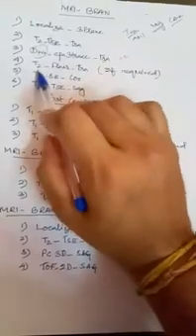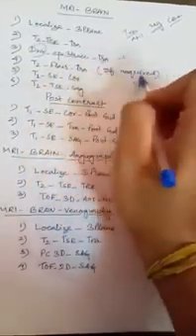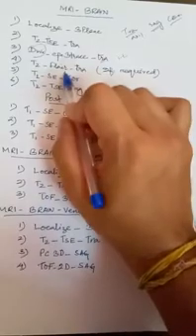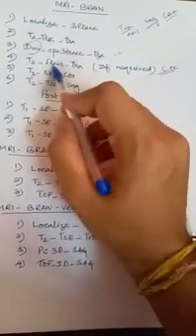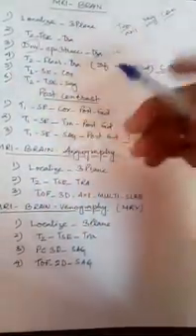Okay, next T2 FLAIR trans if required. That means if it is necessary, then only we are taking this FLAIR sequence. But FLAIR, basically we are having coronal. We need the coronal FLAIR. FLAIR means fluid attenuated inversion recovery. That means we will suppress the fluids in the brain.